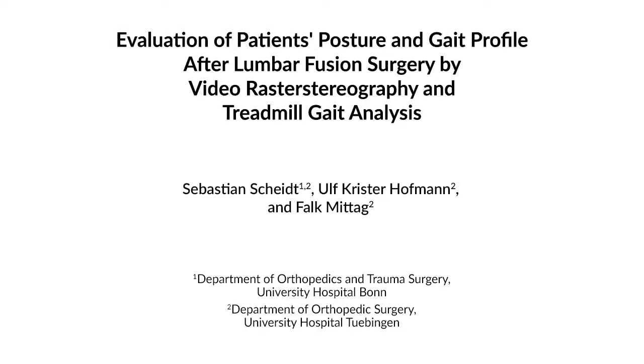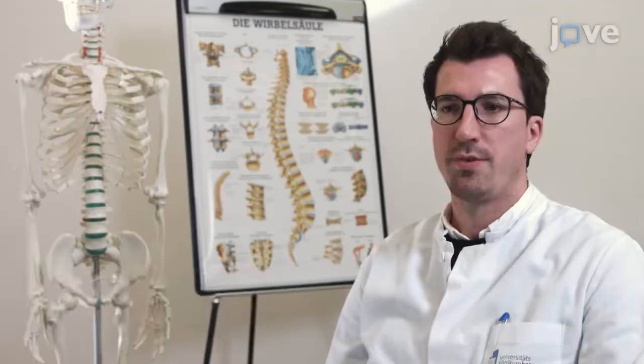With this technique, we are finally able to analyze the gait and posture of patients after spinal surgery in a more objective way compared with the typical widely used questionnaires. The technique is completely free of radiation and, once implemented, feasible with moderate effort. Furthermore, the good validity and high intra- and inter-rater reliability are great advantages of this method.